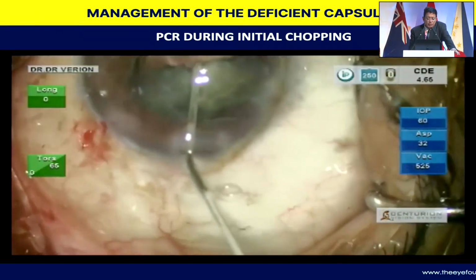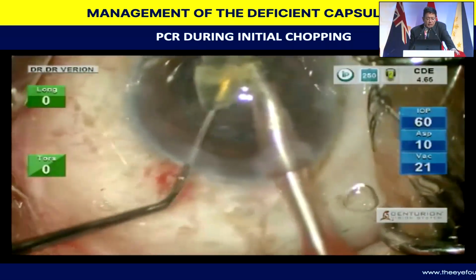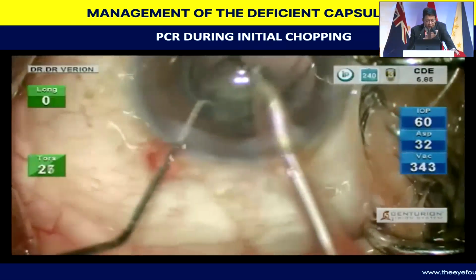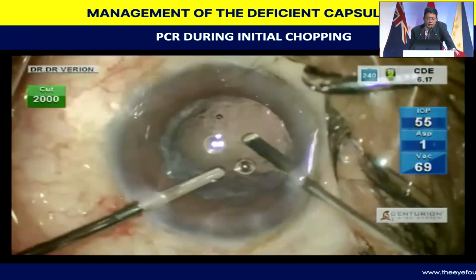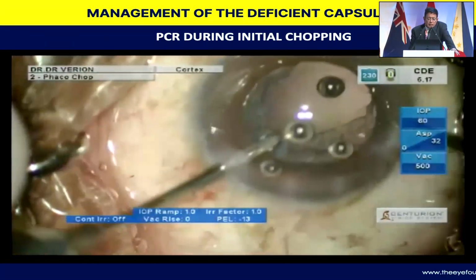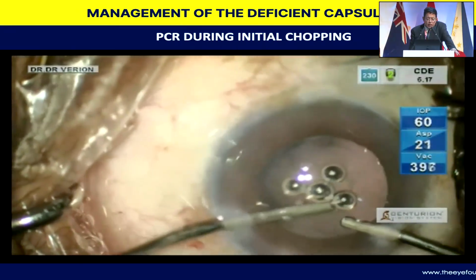You can see the fairly large rent over there, and once again I inject dispersive viscoelastic. The vitreous face is broken, but the idea is to remove as much of the nucleus fragments as possible before I go ahead and do an anterior vitrectomy. And now I do the anterior vitrectomy, where the irrigation cannula is separated, and through the side port the vitrectomy is done, and then subsequently removal of whatever cortical matter is there.